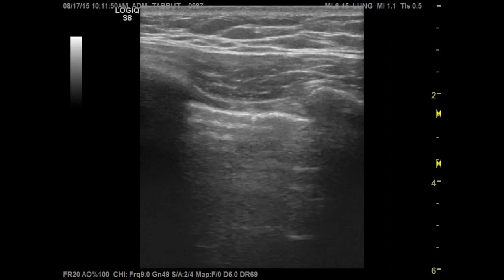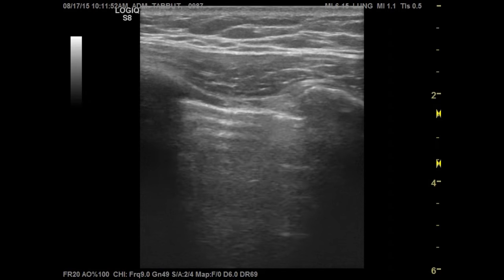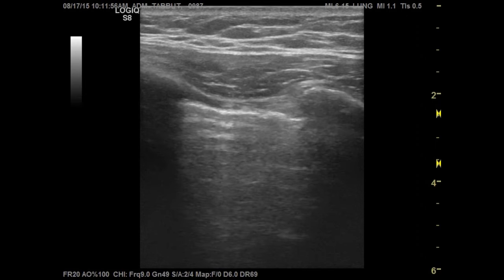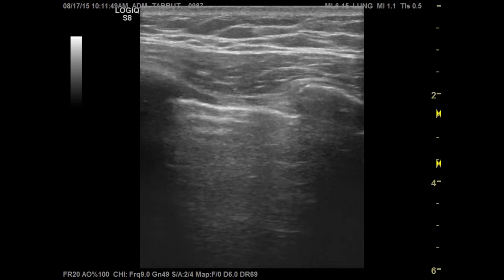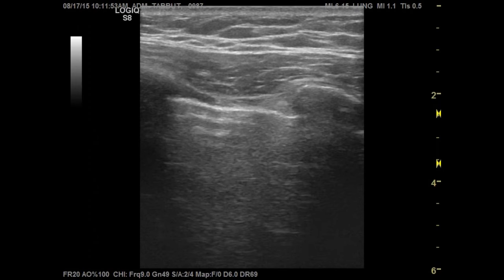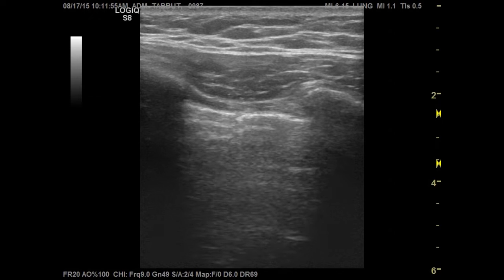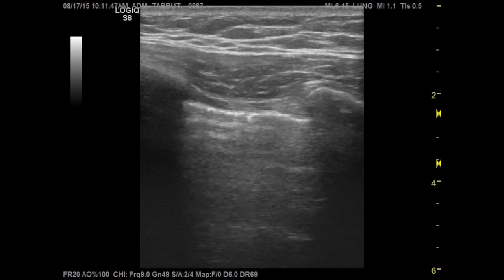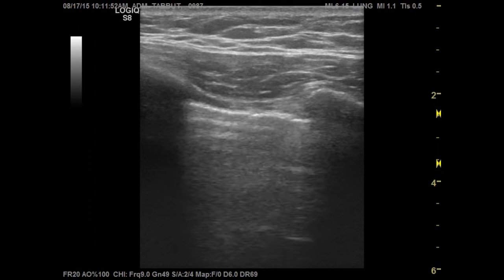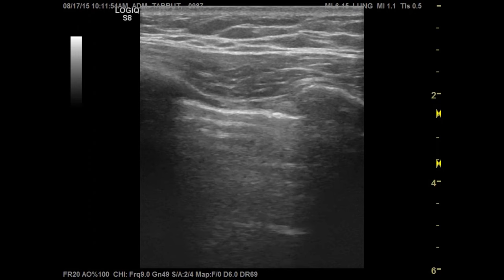We want to see it go left and go right as the patient breathes in and breathes out, to assess whether there is correct apposition of the visceral and the parietal pleura in this patient, right? In this situation, this is an example of me. I've never had a pneumothorax in my life, so this is a normal one, right? This is normal lung sliding as I'm breathing in and out. I took this clip a long time ago, but anyway, I'm still breathing this way, right?